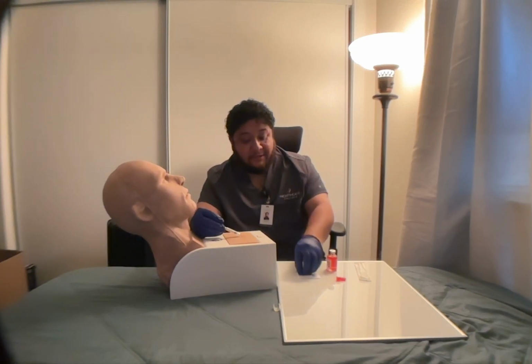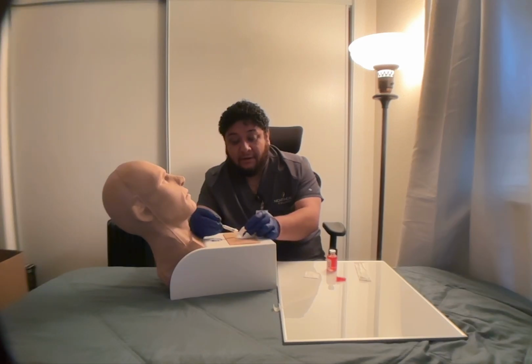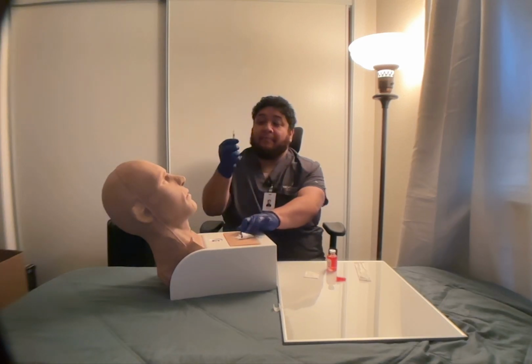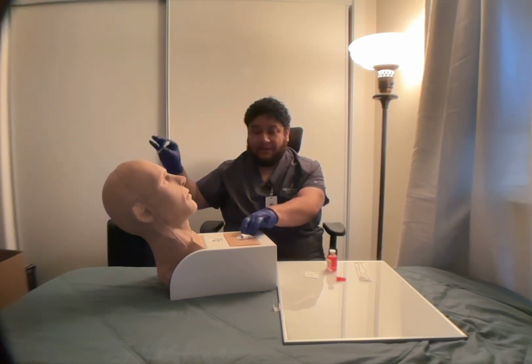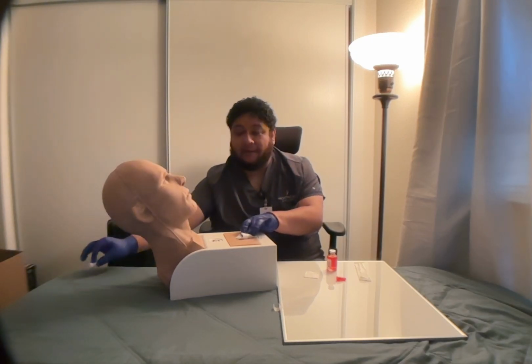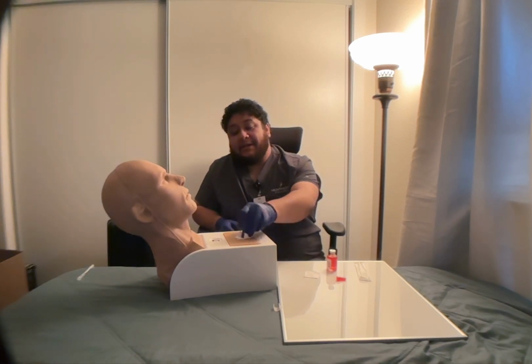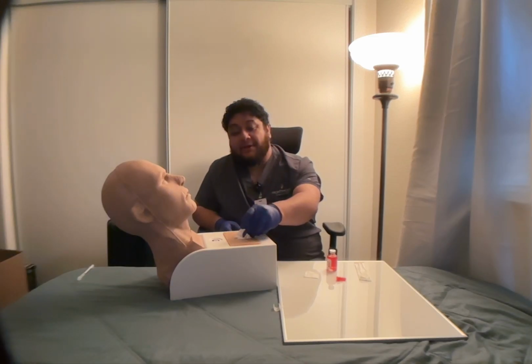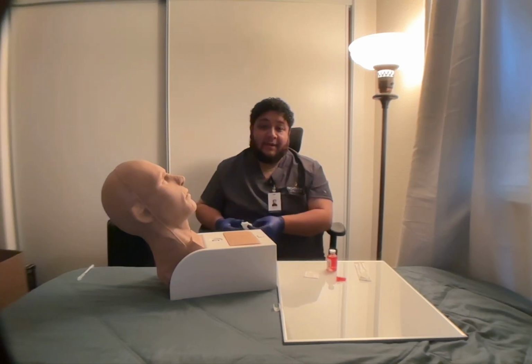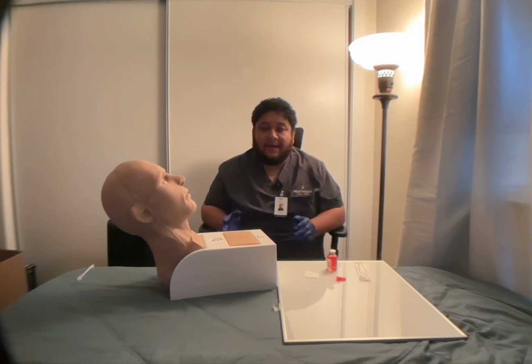Now you're going to get a gauze and slowly, gently apply the gauze while removing the syringe. I'm going to put the safety cap onto the syringe and discard it into the sharps container. I'm just going to leave it here for now. Okay, I'm going to go ahead and check. You don't want to massage when you put the gauze, and you're just going to check for bleeding. If there's bleeding, your patient's going to need a bandage. Since there's no bleeding here, no bandage is necessary.